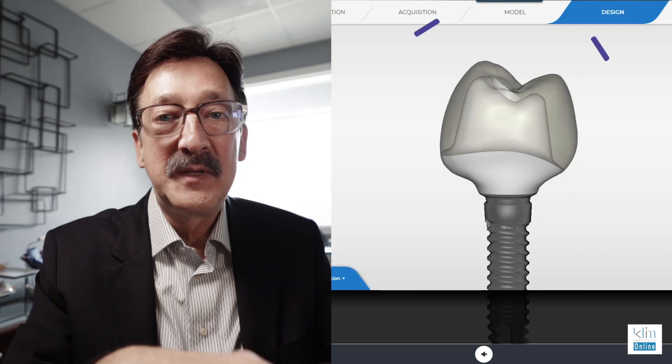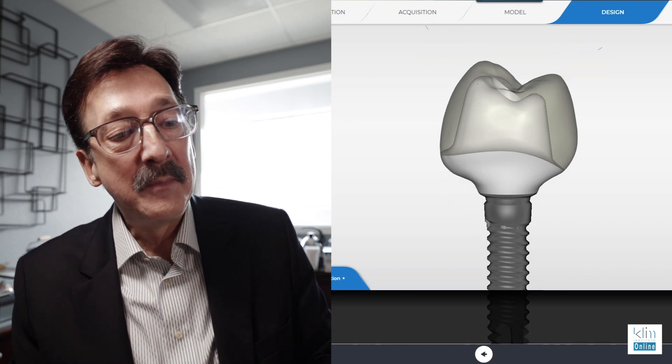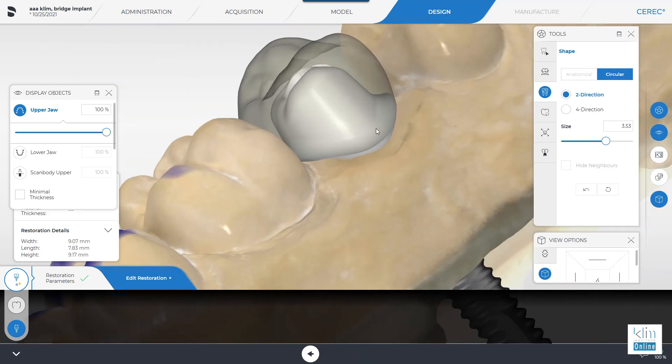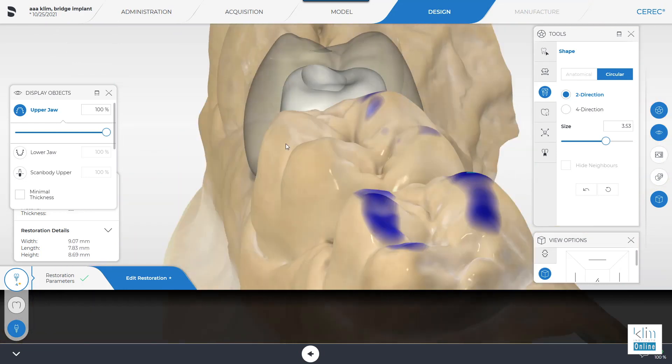Number three: when you have an abutment proposed posteriorly, it actually proposes beautiful cusp zones on the abutment. And they can be sharp, which creates a problem with the mill on the intaglial surface of your crown. So with the two-directional tool, take and lower those abutment cusp tips down so they're a little more flat and not as sharp. With that, you don't have a milling issue.